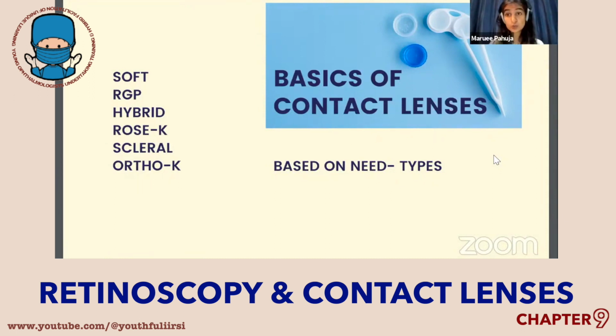These lenses are also used especially in irregular corneas. And then there is a Rose K lens, with the K standing for keratoconus. And just like Rose K lenses, there are scleral lenses, which are also used for keratoconus, or many types of irregular corneas, also in cases of ocular surface diseases.